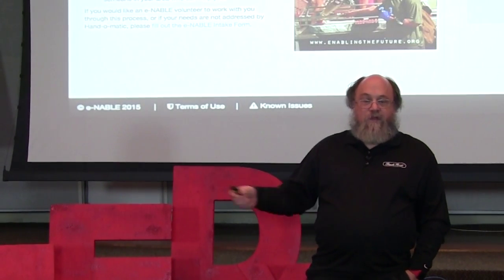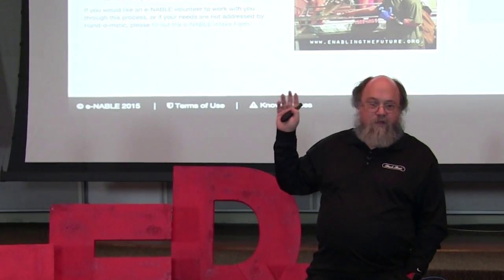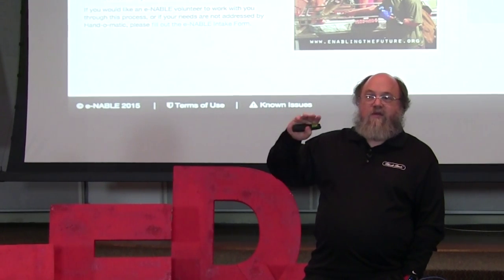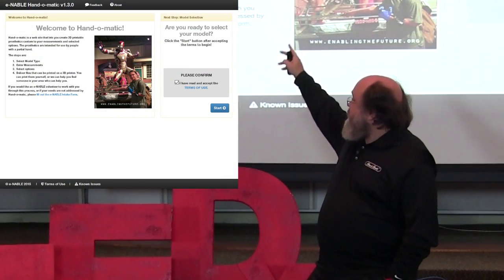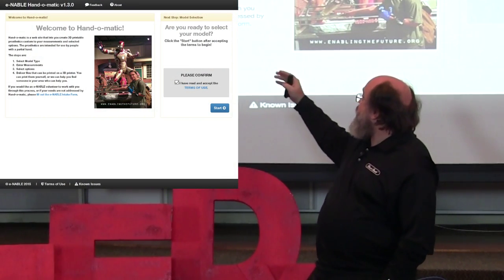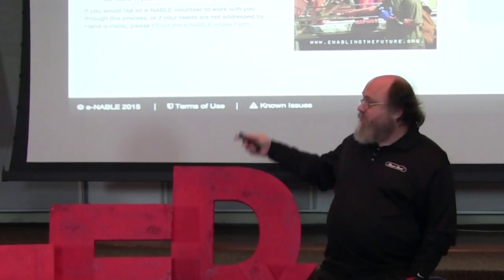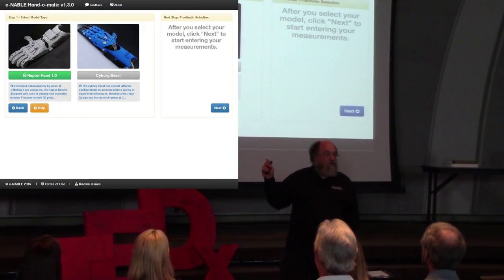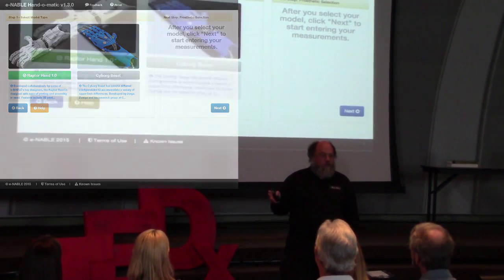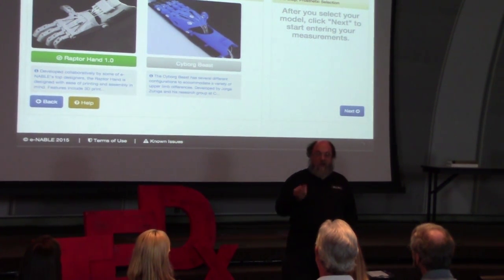And of course, it starts out as a website, and if you go to enablingthefuture.org, you get a link to Handomatic. So I'll just say enablingthefuture.org a bunch of times. The first page explains the process a little bit. You pick your model, you enter some measurements, you pick some options, and it gives you some files to print. And of course, there's a disclaimer bit because lawyers. In this case, there's two designs wired in there, one called the Raptor Hand and one called Cyborg Beast, developed by two different teams inside eNABLE. And when you read about them, it links to more information. You pick which style you like.